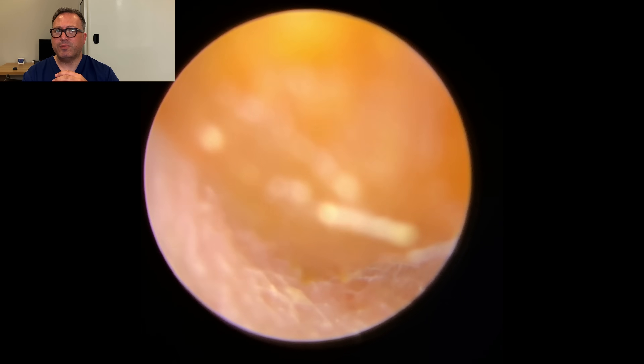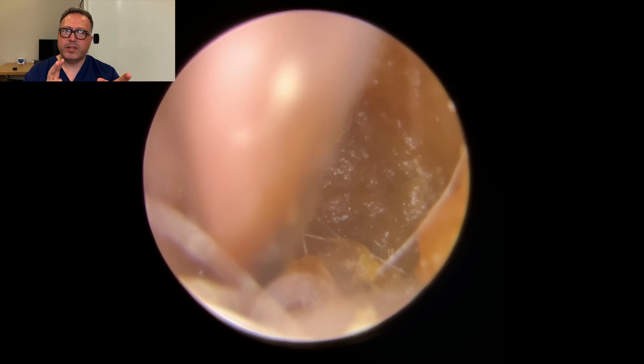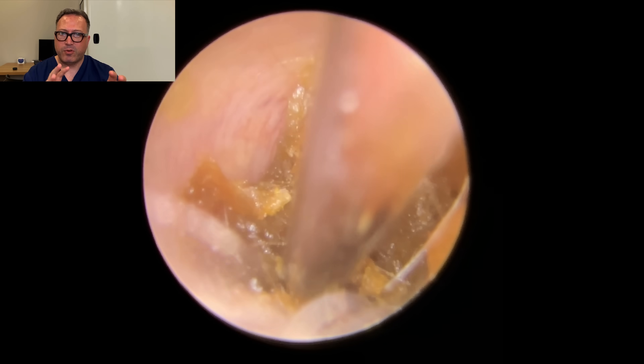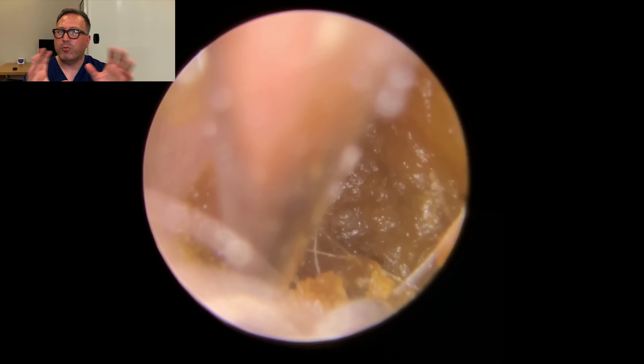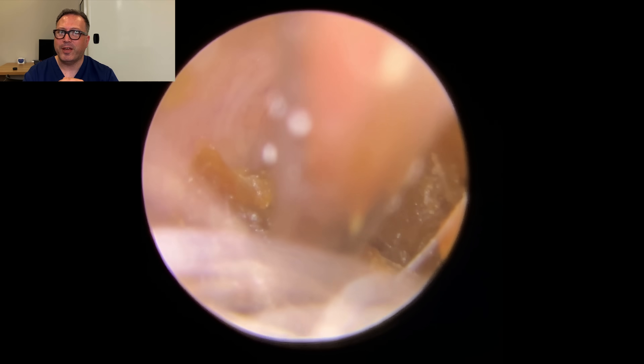So we've got a good grip there with the little fine end, slowly working this one out. This is a long video — it goes on for about 18 minutes altogether, but it's definitely worth a watch. So try and stick with us to the end — there are some really, really good skin ribbons in here along the way.